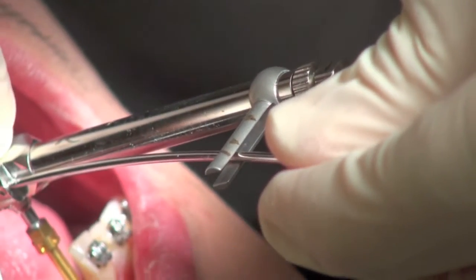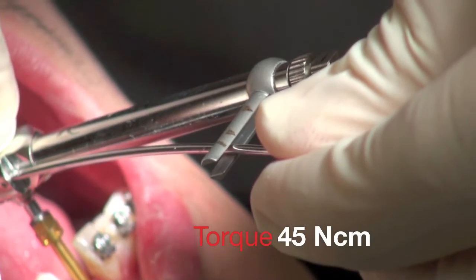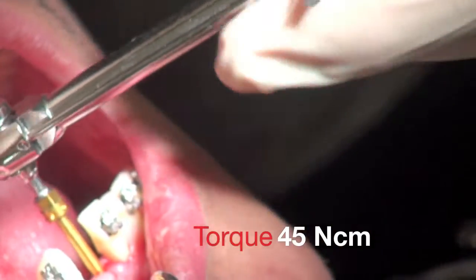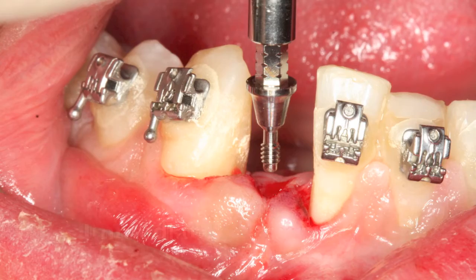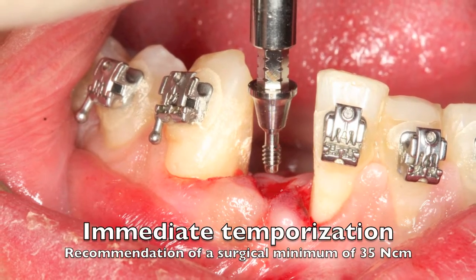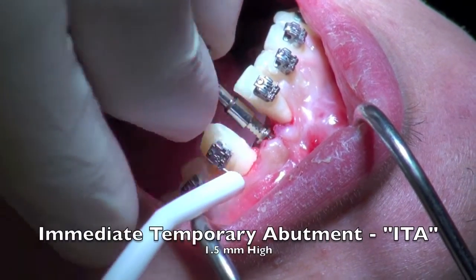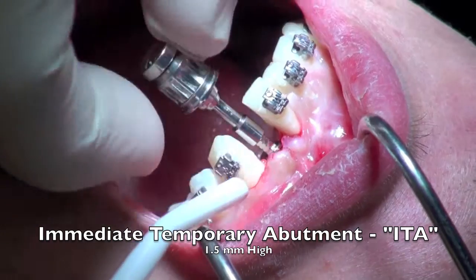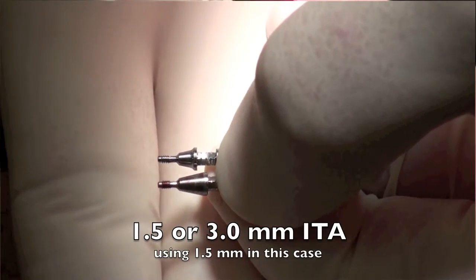We can see that the implant did torque to 45 newtons, which is just absolutely perfect. Anything over 35 newtons enables me to put on the immediate temporary abutment. The immediate temporary abutment is a fantastic way to put a cement-retained temporary on this system, and so this gets screwed down on top of the implant.